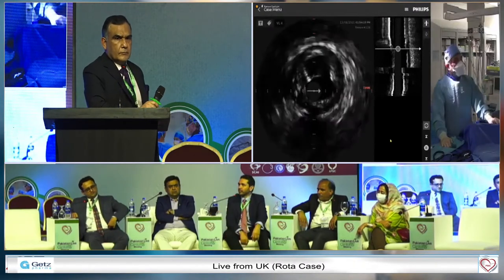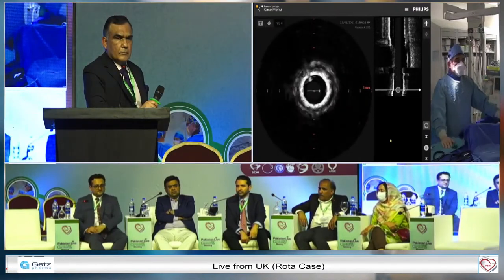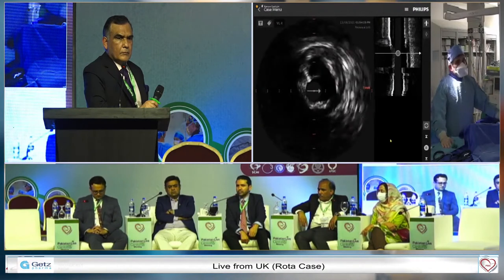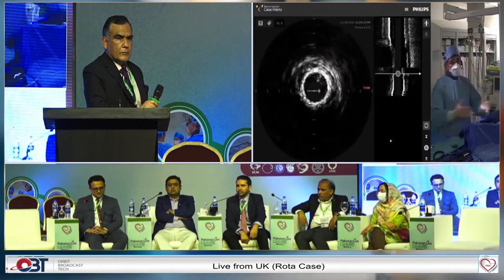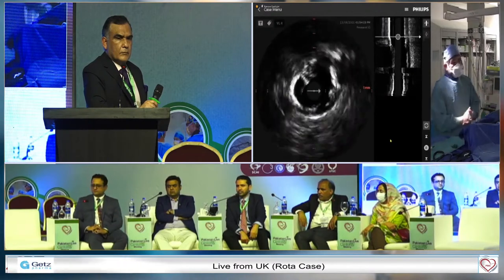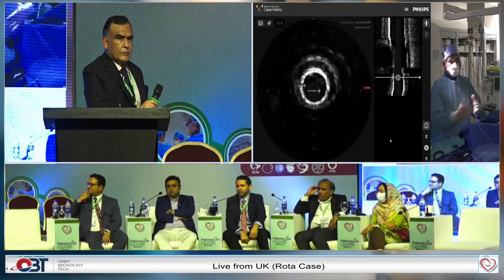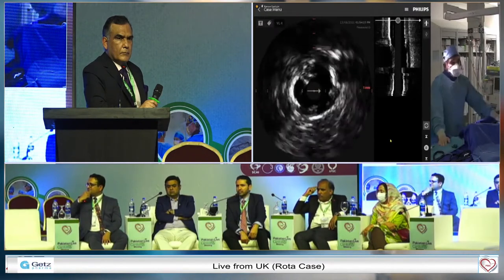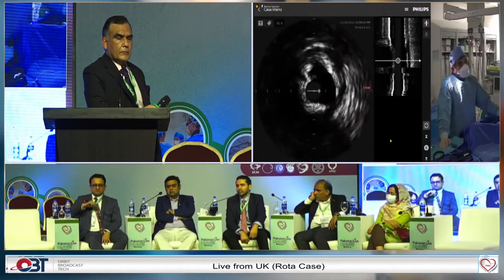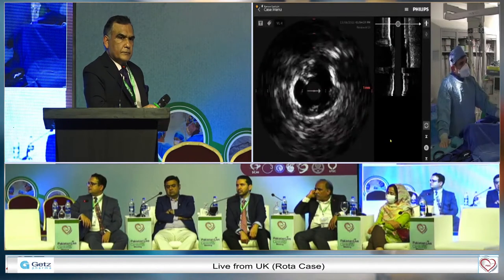I think you can. To my mind, particularly in places like yours where IVL is not easily available, using the two technologies may be needed, but in very few cases. You end up spending a lot of money. If you're going to do rotablation, you need to do it properly, i.e. size correctly. And for the last how many years you've been doing it without much problems. Use a 1.25 in the big artery and then take the IVL. Yes, it's okay, but it's a kind of double cost that, to me, can be overcome. Although there are probably 1-3% cases that you may need both. But yes, it's a valid thing.